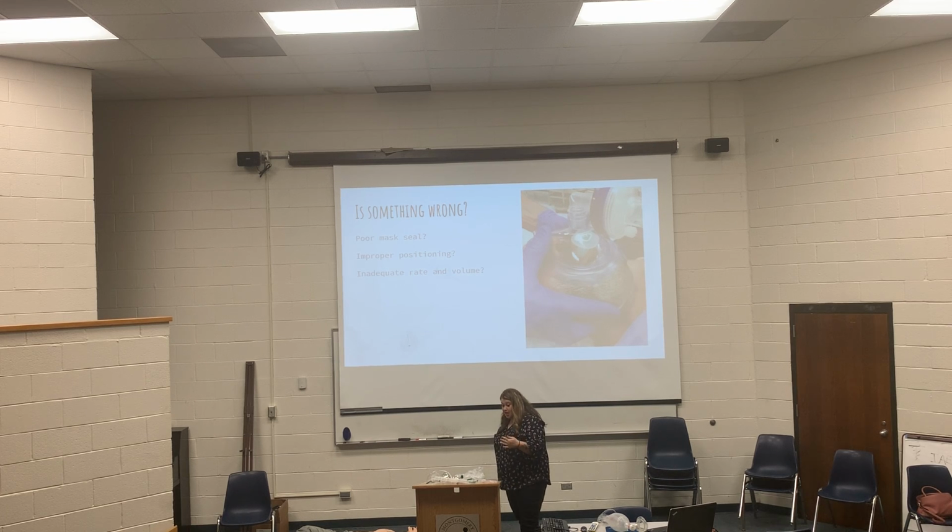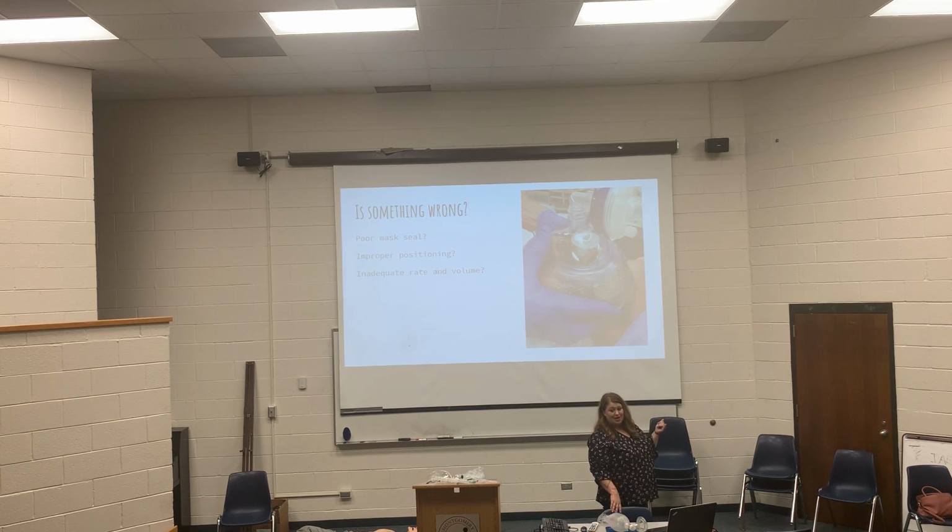So you want to check to make sure that the oxygen is on, because believe it or not, that happens more than you would think. Sometimes the oxygen tank will run out and you don't even notice. When you're bagging somebody in cardiac arrest and you're working that patient for 40, 45 minutes, you are going to go through a bottle of oxygen without fail every time.